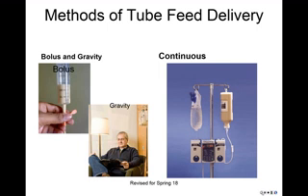So pictured here, we see the three methods: bolus, through the open-ended barrel of a syringe; gravity, the tube feeding has been placed in a bag and it's going in a little bit more slowly over 30 to 60 minutes, and then continuously on the electronic pump.